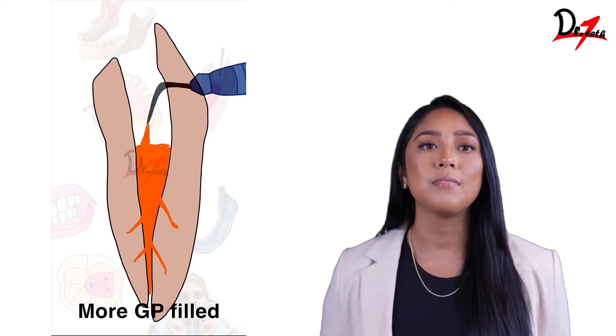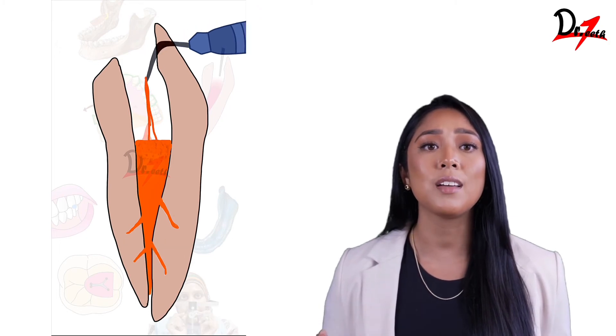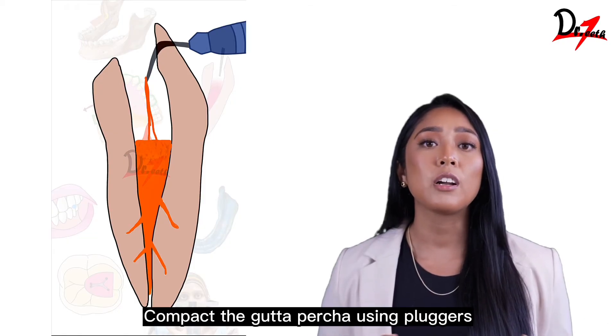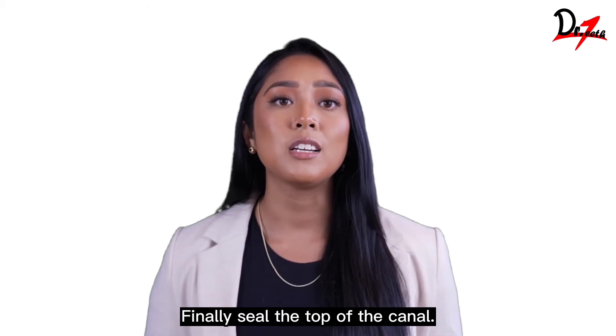Stage 5: Filling the canal. The gutta percha delivering handpiece will deliver softened gutta percha. Inject the gutta percha into the canal, filling it incrementally. Compact the gutta percha using pluggers while it's still warm. Repeat the process until the entire canal is filled. Finally, seal the top of the canal.